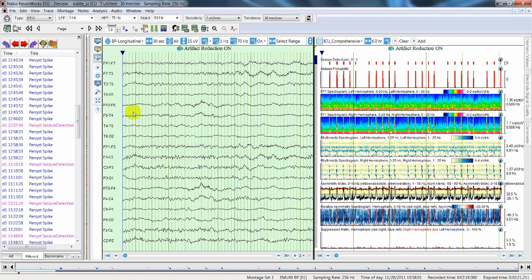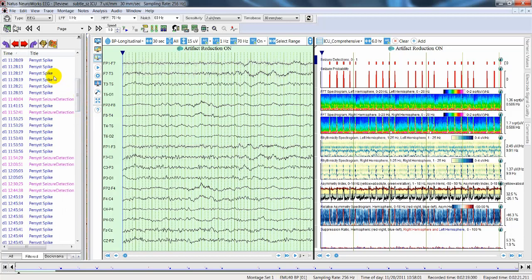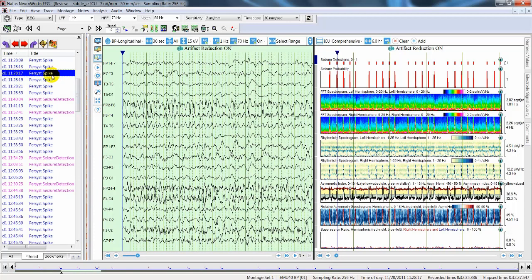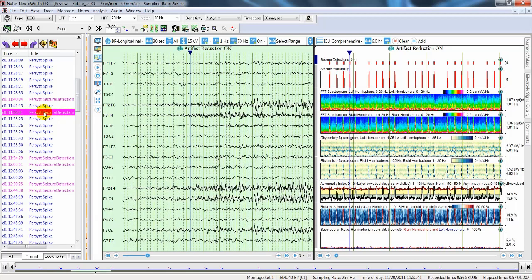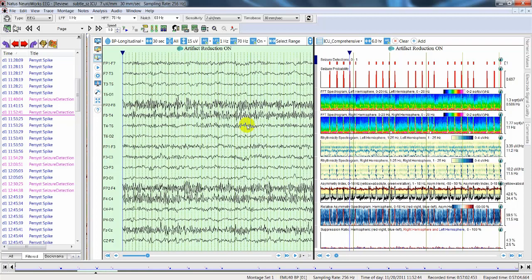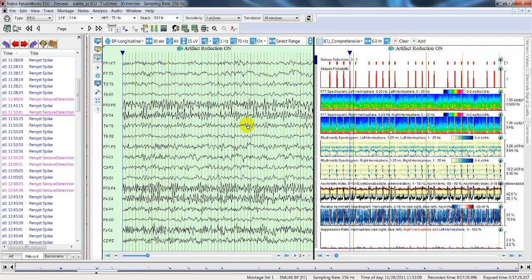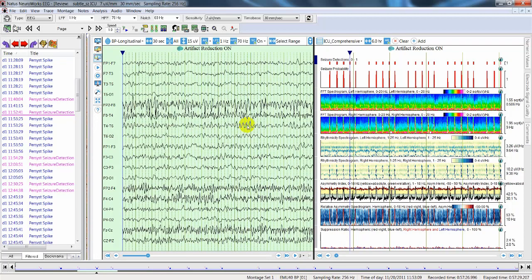The events in the annotation viewer, the EEG view, and the trends view are synchronized, so if you click on an event in the list, the EEG waveforms and the trends jump to the same point, allowing you to rapidly review the EEG and critical events like spikes and seizures that occurred during the monitoring.